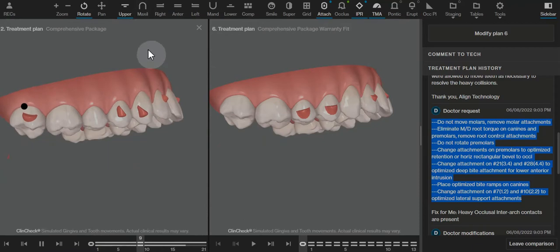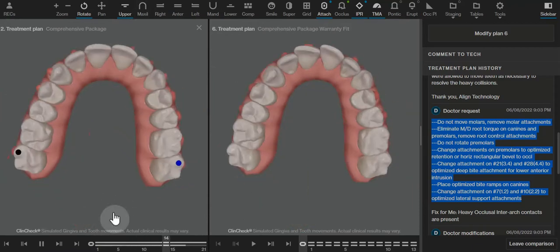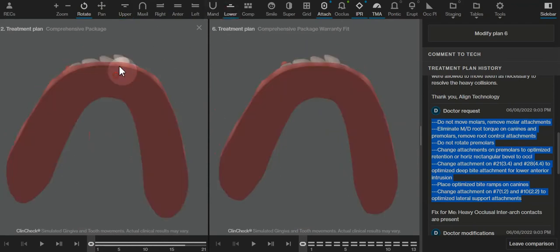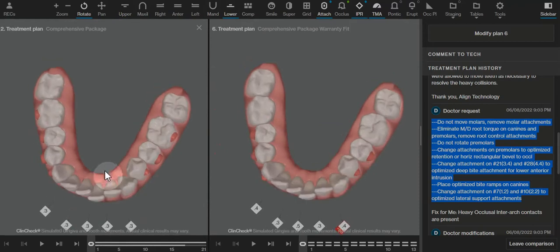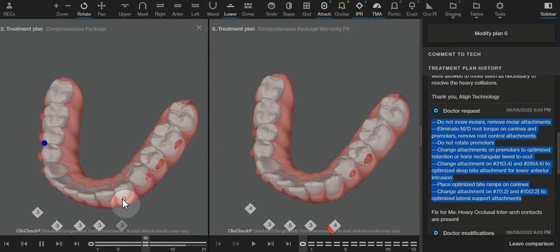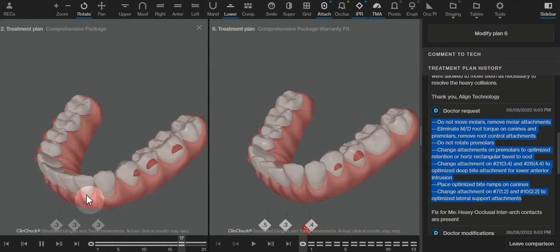But looking at this patient's initial arch form, they already have a sufficiently wide arch. It's really just uncrowding, mostly canine through canine. So this is not a case that would really warrant moving the molars, and the second molar movements are never going to reliably happen. And then from there, I like to look at the premolars and see what's going on.